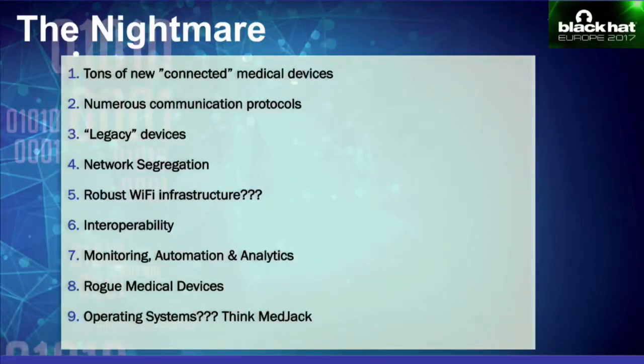And if you combine that with portable medical devices that patients will start to bring with them, for example, if I am diabetic, I could buy an insulin pump and take that to my medical institution and tell them to associate it with the hospital network. So hospitals will have to make sure that they have enough bandwidth to support all these devices so that their wireless or wired infrastructure does not choke when all these devices connect.